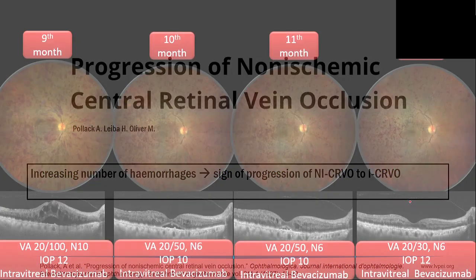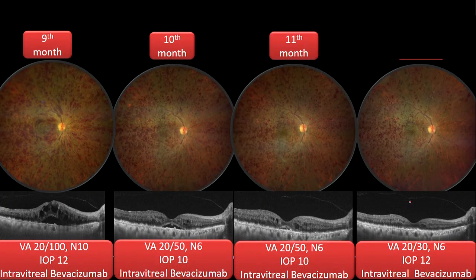So now let's come back to our case and look at the response we got after treatment. Over the course of time, we can see that those superficial hemorrhages as well as the dot and blot hemorrhages are resolving, and the macular edema is also resolving, and the visual acuity is coming back to 20 by 30.